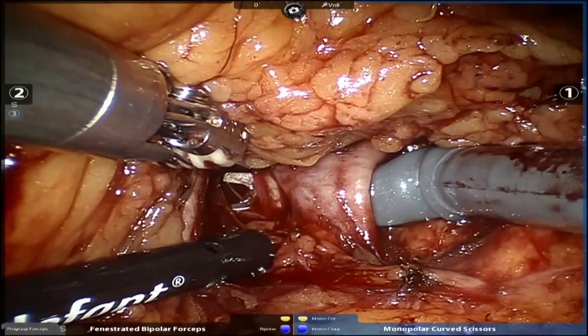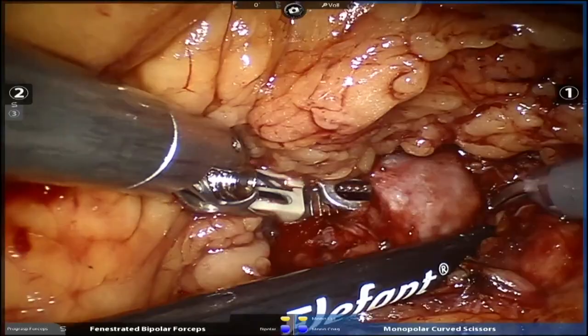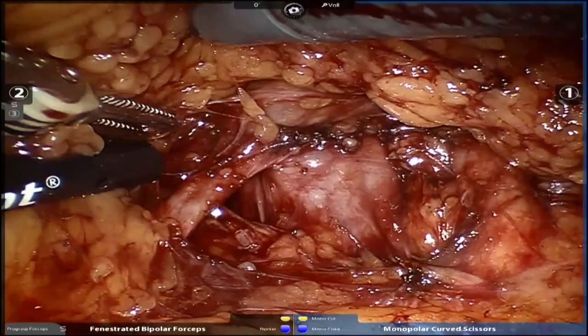It's nice you have such an experienced assistant because, as you know, for an assistant, this can be a make or break thing because the anatomy and the landmarks are relatively limited to the person who's not familiar with the retroperitoneal approach. That's why Brandon got on the airplane, believe me, because the assistant is very important.